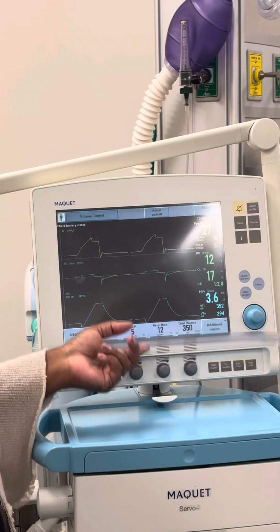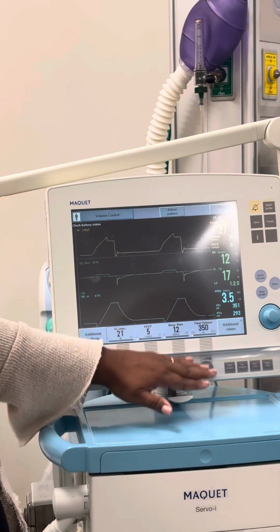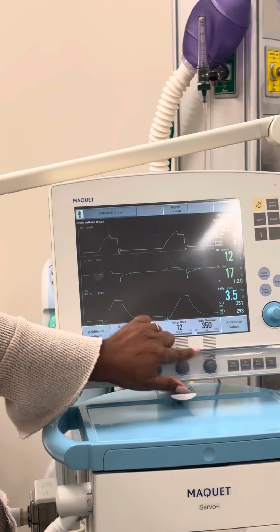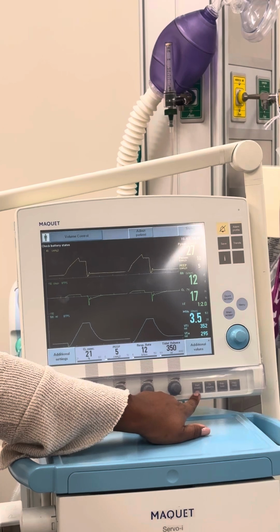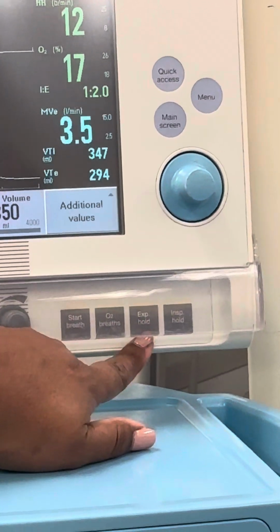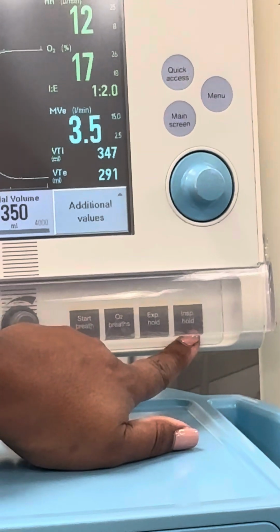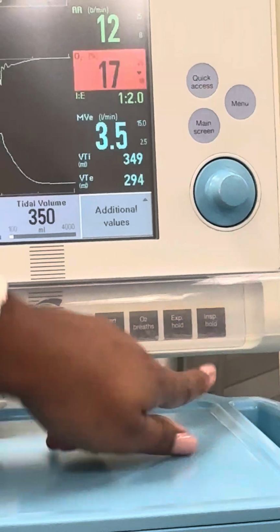But what else is over here while I'm here? O2 breath. You can see these match up with those, right? That matches up with these. You have a start breath, so that's like a manual breath. That's an O2 breath for 100% O2 for 2 minutes. Expiratory hold and inspiratory hold. That's how you would get what? Your plateau pressure, your compliance and resistance.